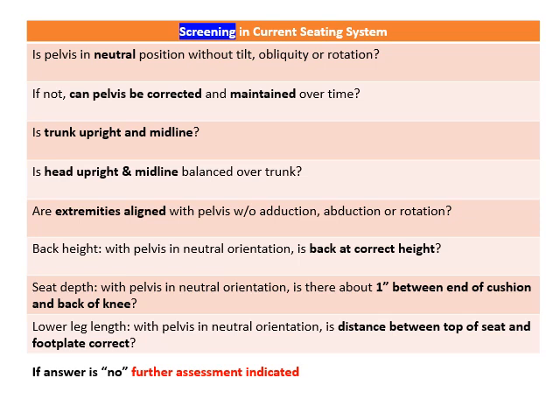That's so the person, if they need to flex their knee, for example, tuck their feet underneath their knees to transfer, has room to do that. And we'll learn more about the importance of being able to flex the knees and position the feet underneath the knees in preparation for shifting weight and transfer. So that's an important measurement. We'll get into that in a little bit.